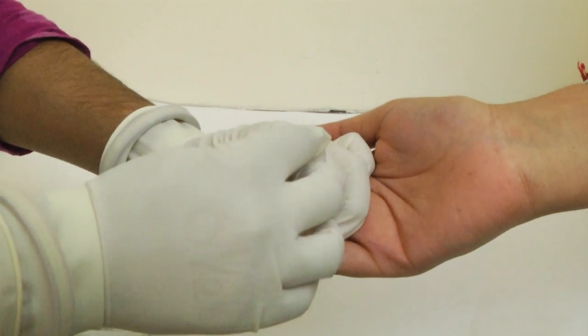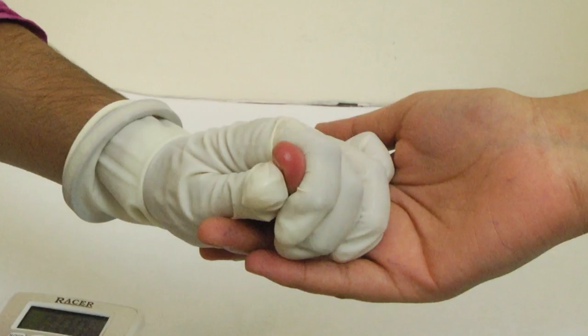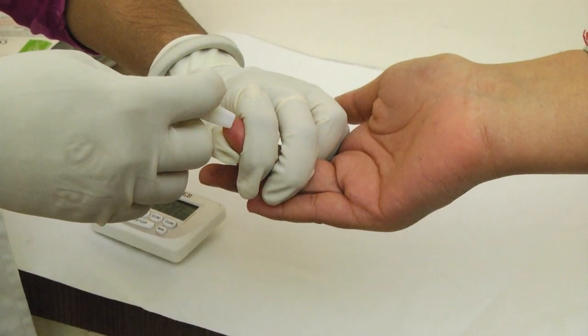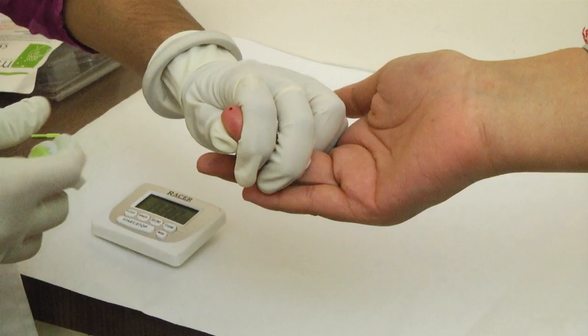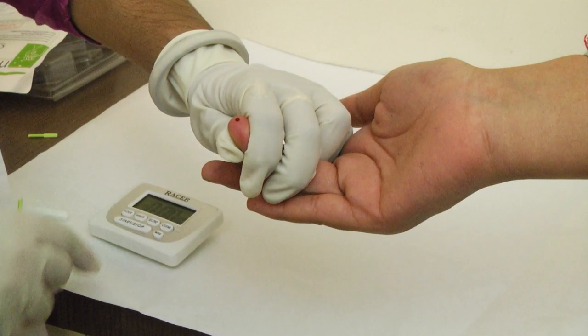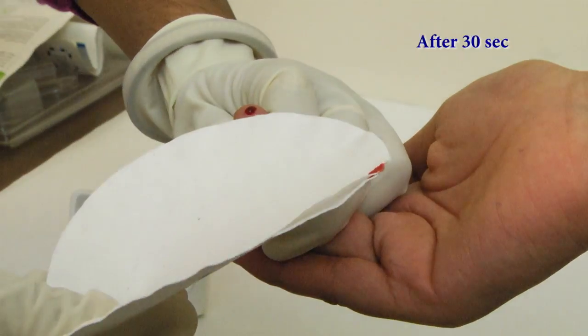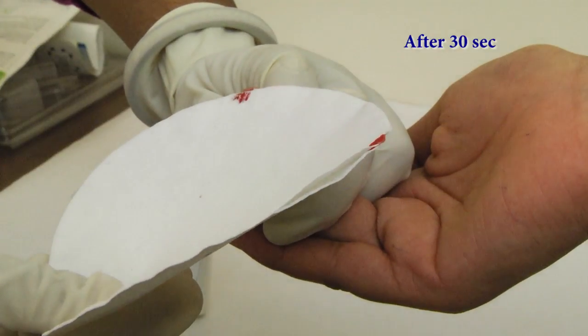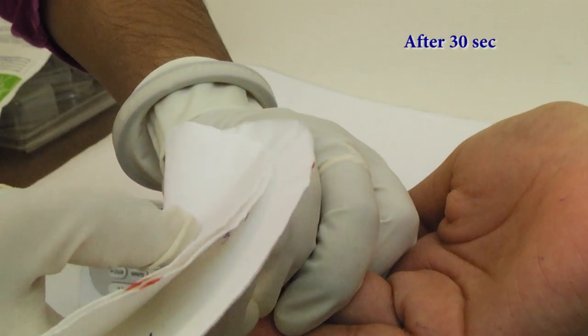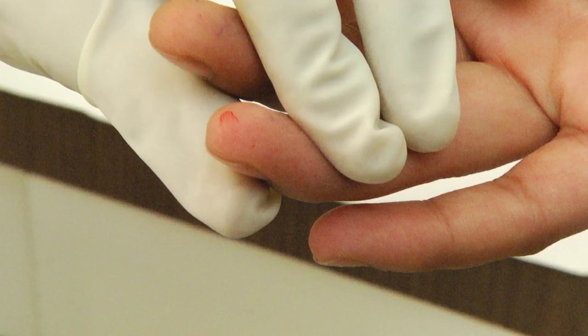Procedure: With the Duke method, the patient is pricked with a lancet, preferably on the earlobe or fingertip, after having been swabbed with alcohol. Let the alcohol dry. Prick the fingertip — the prick should be about 3-4 mm deep. At the same time, start the stopwatch. Wipe the blood every 30 seconds with a filter paper, taking care to wipe it from the side and not directly on the puncture site. The test ceases when bleeding ceases.